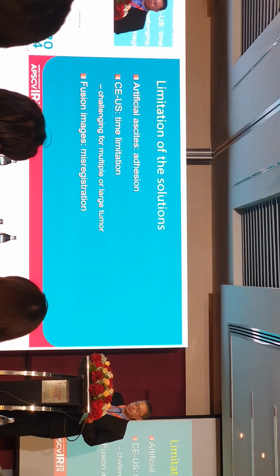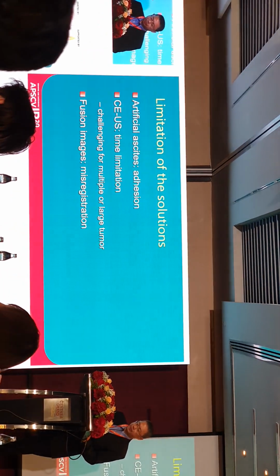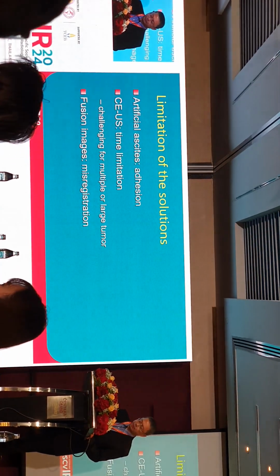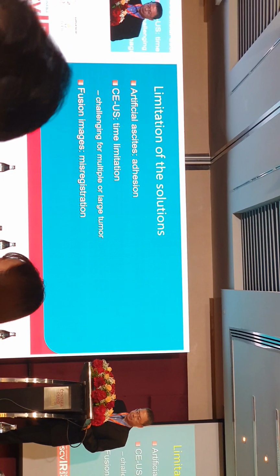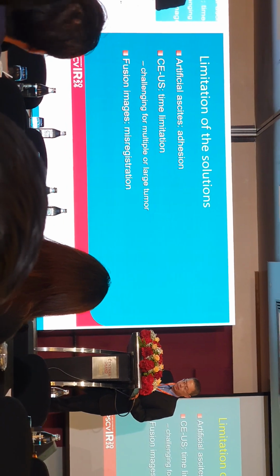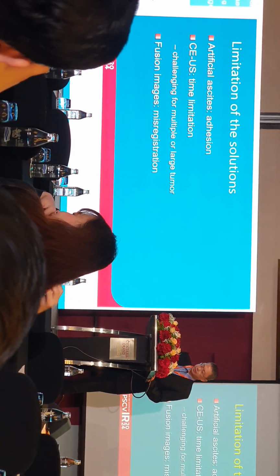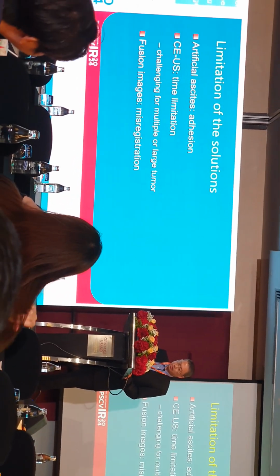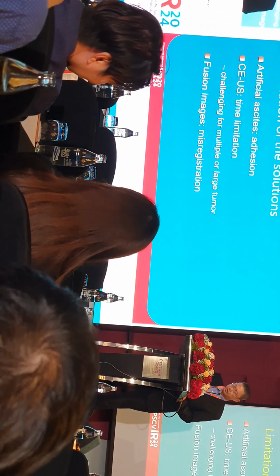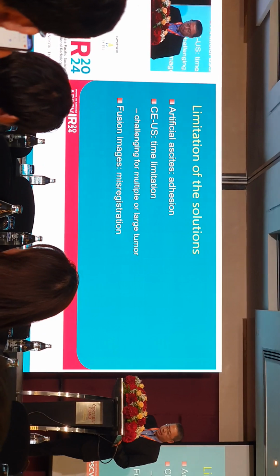However, there is still a limitation of the solutions, such as if the patient has had an operation, the adhesion will limit the artificial ascites, and it cannot successfully separate the liver from the diaphragm. And for contrast enhanced ultrasound, there is a time limitation for multiple or large tumors, so it is not easy to complete ablation. We cannot see the tumor all the time. And another limitation is that when we use fusion image and the patient changes position, we easily misregister the lesion by ultrasound guide.